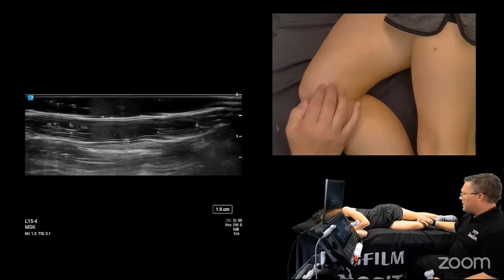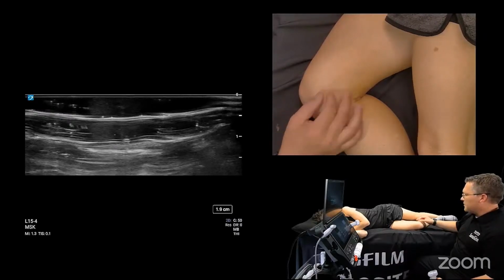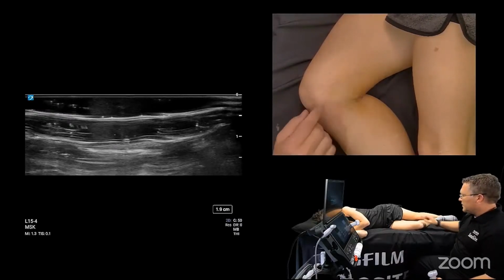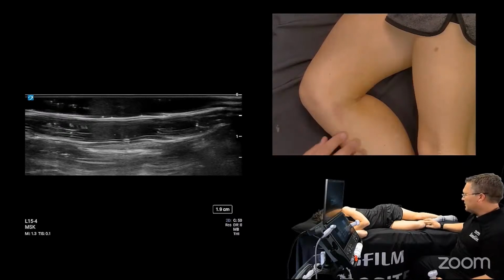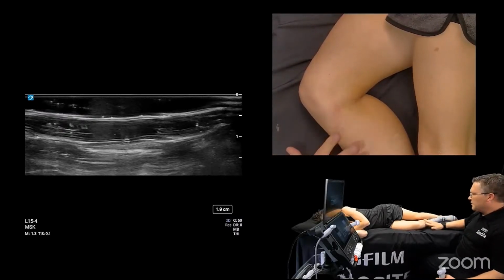So I can palpate this medial epicondyle. You could go for the joint line if it's not so obvious first. So I can feel medial femur, I can feel medial tibia, chase those medially, and then go proximal and feel for that bony ridge right there. Then you want to palpate that medial neck of the tibia that I was talking about and get a real feel for it.